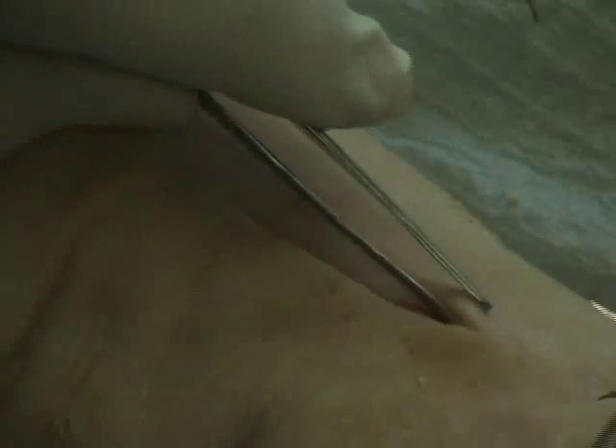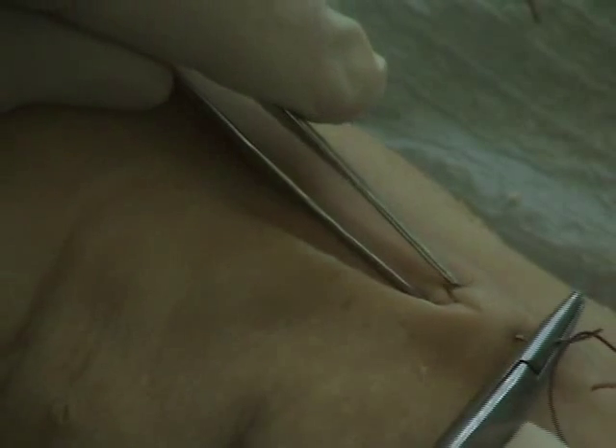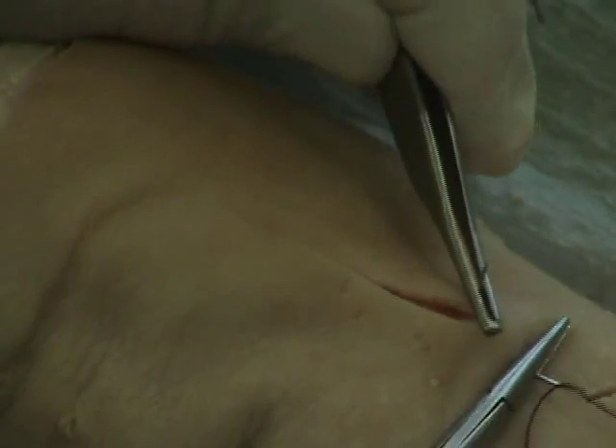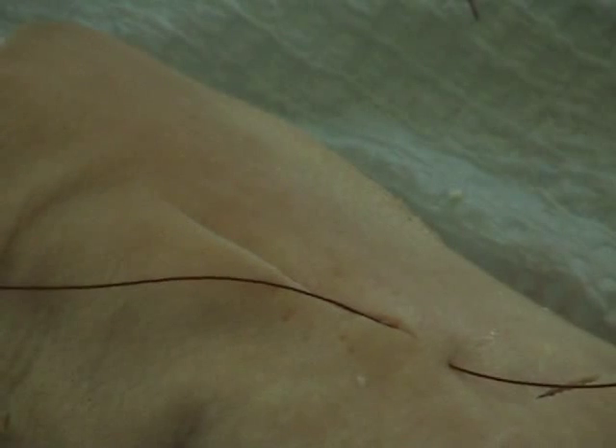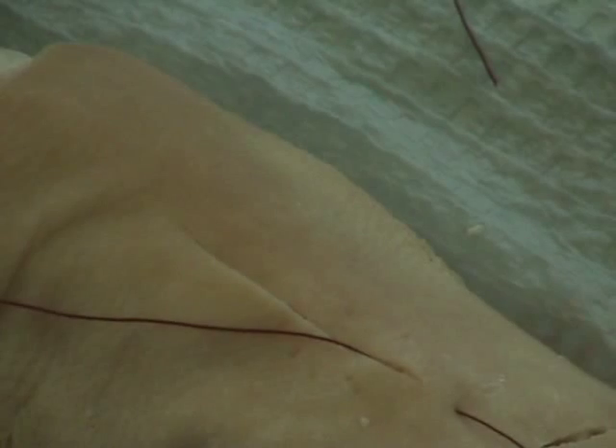We start at the end, about a quarter to half an inch back from the end, and pop up right in the corner. Support it with the needle forceps and pull the thread through. I do not typically tie off this first end until I complete the stitch, because I may need to pull from both ends if it's a longer incision.